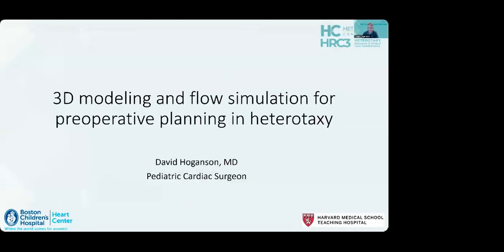I'm going to share with you some of our efforts in using 3D modeling and flow simulation for preoperative planning in patients with heterotaxy and complex congenital heart disease.